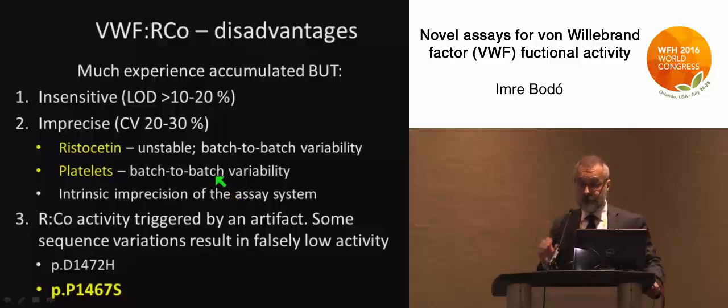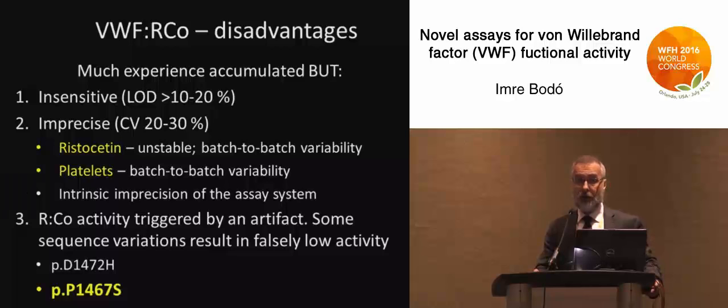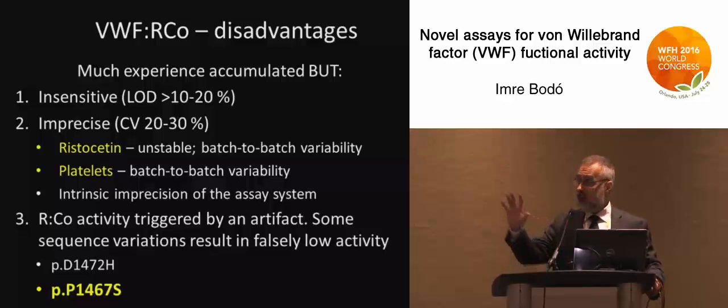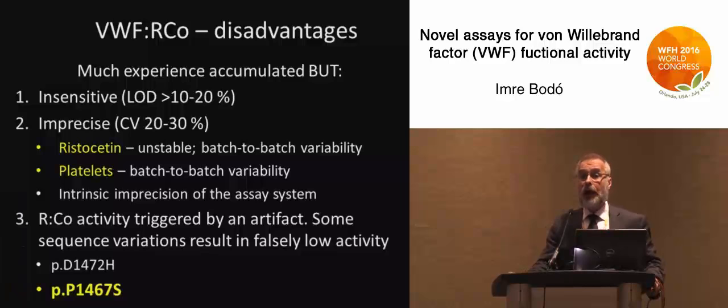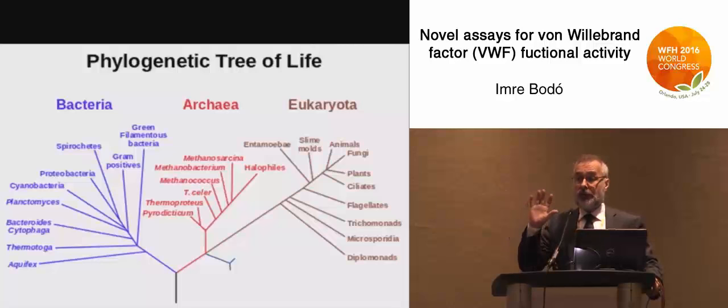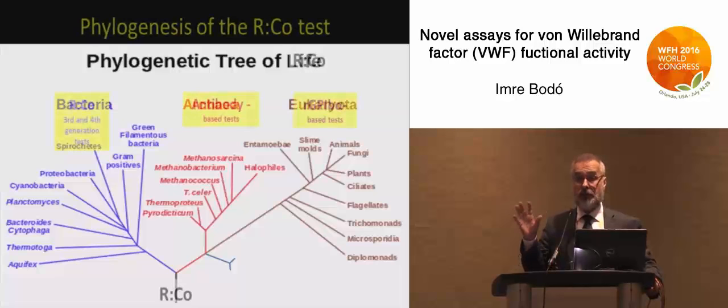Not surprisingly, several genetic variations were found that affect the ristocetin binding site on the protein, giving a falsely low ristocetin cofactor activity, whereas these patients do not bleed. Their von Willebrand factor in vivo is physiologically completely normal. Highlighted is the proline-1467 serine substitution — remember that number, it will come up again. This is not an insignificant problem; in certain populations such as African Americans, these variations affect more than half of the population. So what do you do with an assay that is falsely wrong in half of the population?